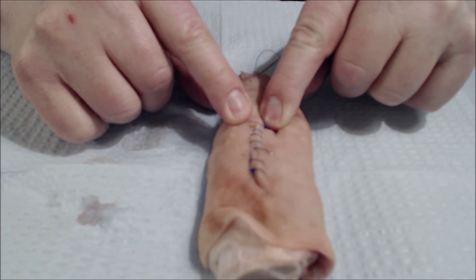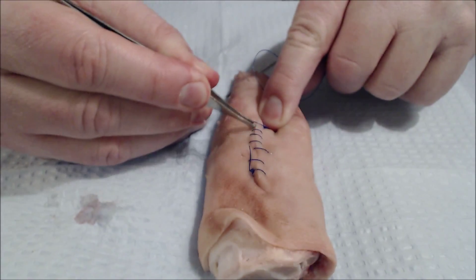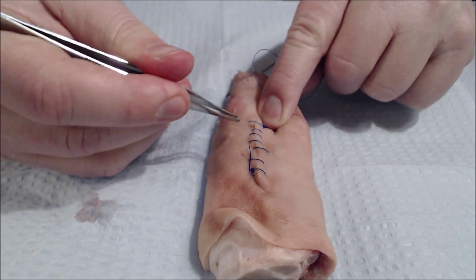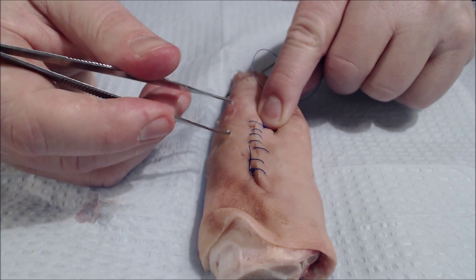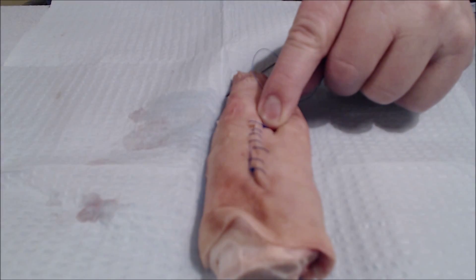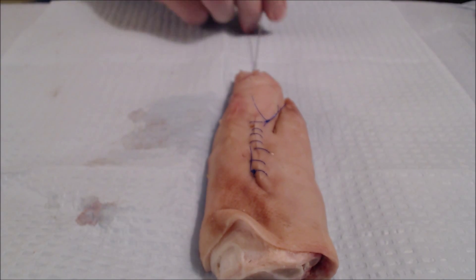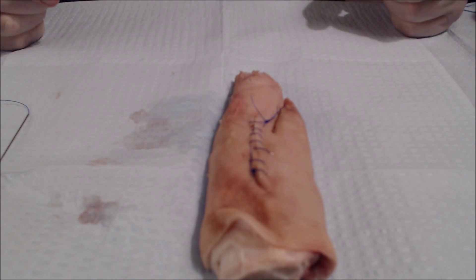You can see I didn't quite get the ends of my suture equidistant from the laceration, and that's okay — because in the field when you do this, especially if you're trying to do it quickly, it's not going to look pretty. You just want to close it quickly so it'll stop bleeding and you can get moving to your bug out location. Simply cut the suture, put a dressing over it, and that would be a running suture using a straight needle.